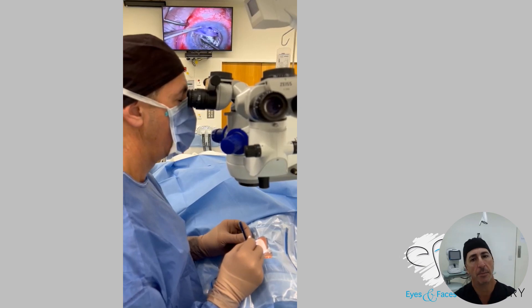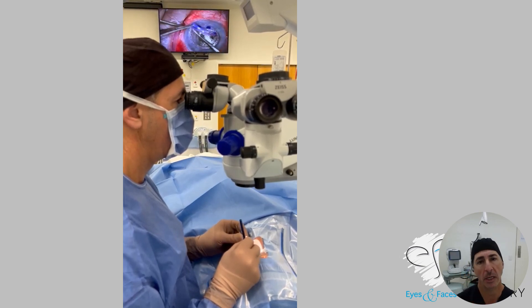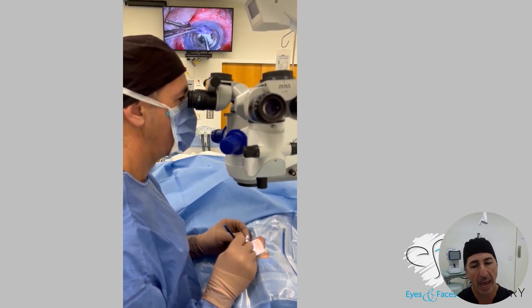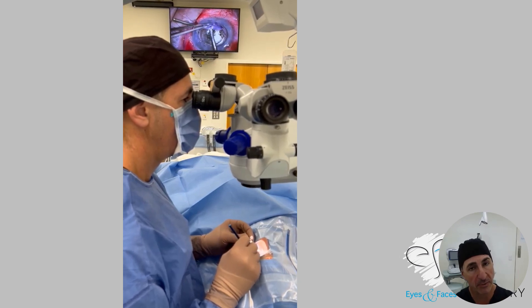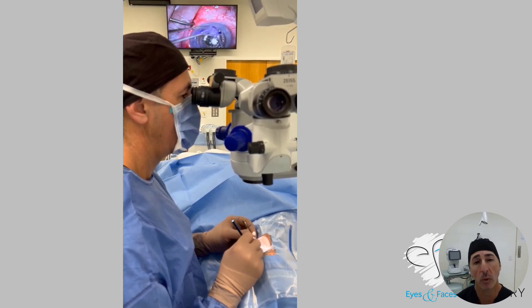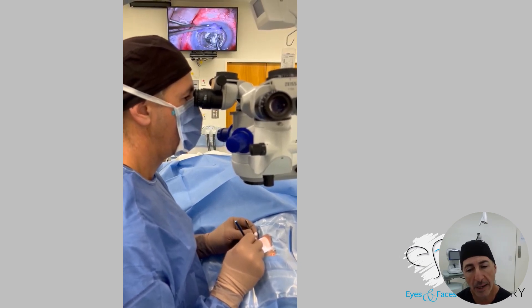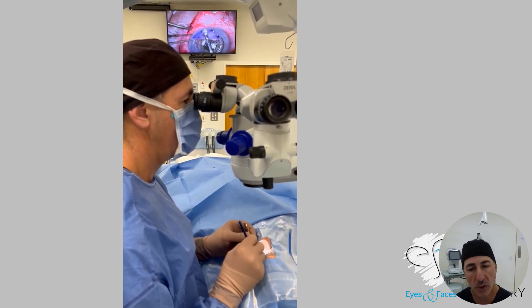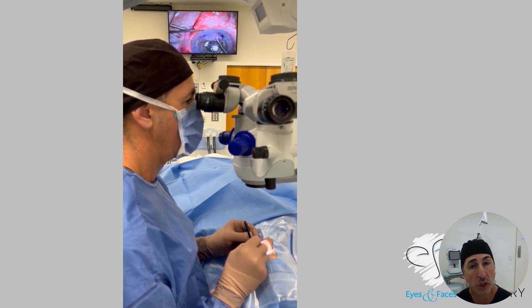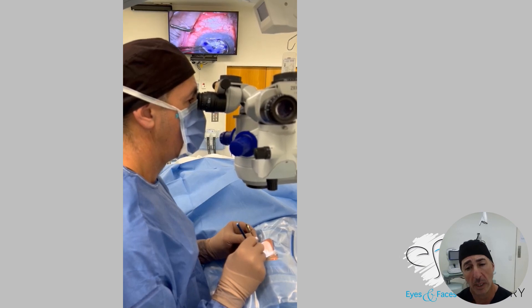Everything is kept in a very firm but relaxed position — very much like the posture meditators take sitting cross-legged, holding their body up straight, because they have to. That body posture then provides feedback to their mind. Here, my body provides feedback to my mind, and I'm literally watching my hands at work. I'm not even thinking about what to do; my eyes are guiding them. The body is taking care of itself. It really is quite a discipline, because as you'll see from the top view, there's a lot of movement going on, and I'm literally just tracking and watching it — not directing it. It's quite meditative, a state of flow where skill meets challenge.